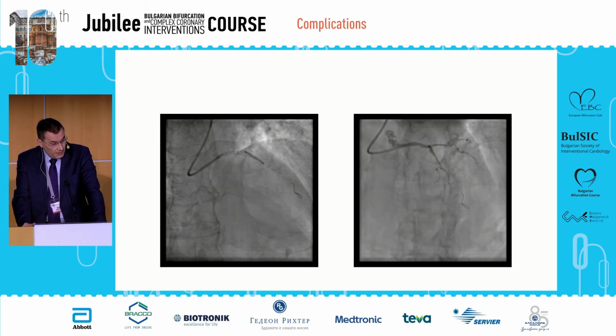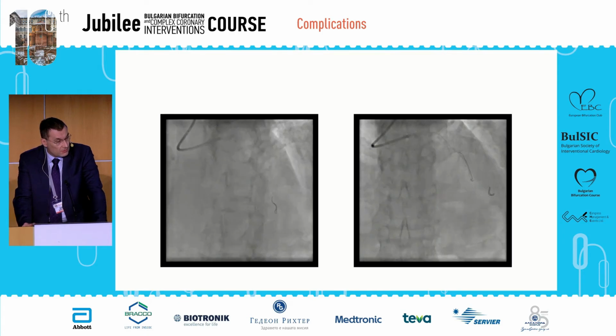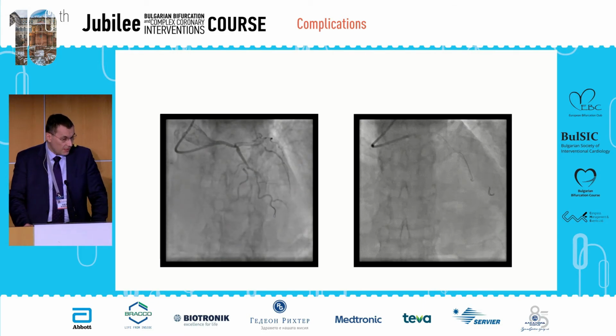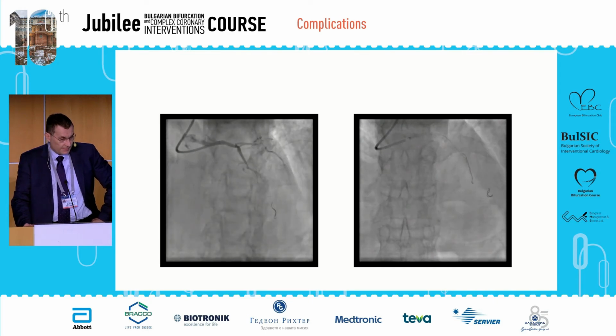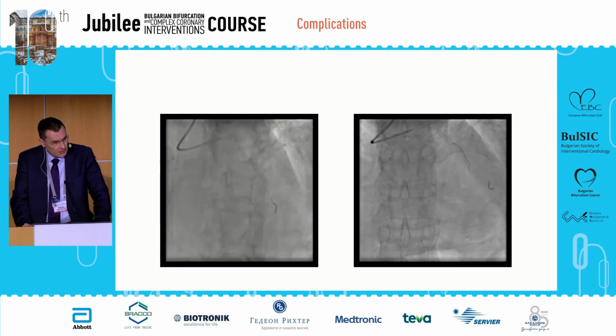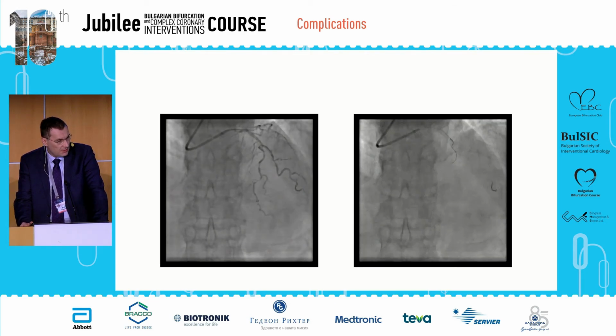After that, I placed a Trio stent proximal to the bifurcation, just to make manipulation of the wire easier. However, it was again not possible to wire the LAD. Then I switched to reverse wiring with Sasuke and Fielder FC. This is after special preparation of the Fielder and Sasuke.